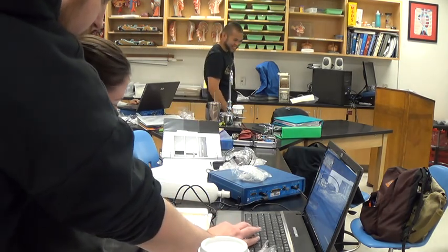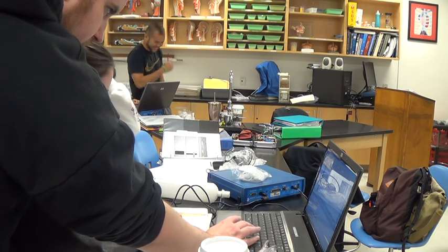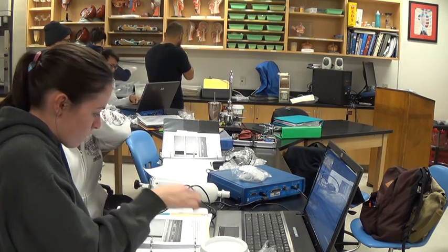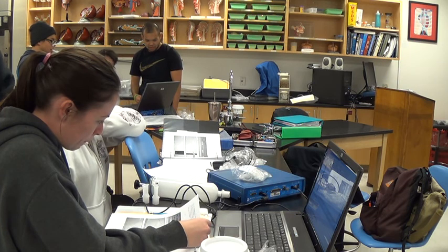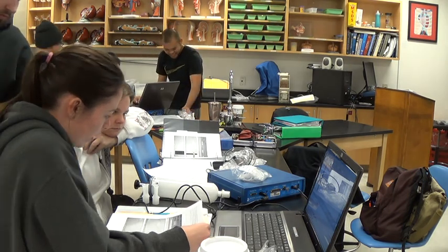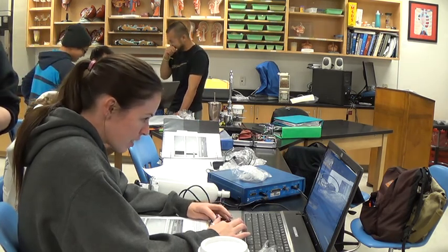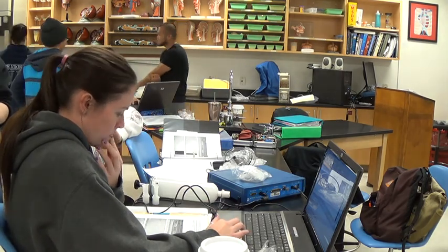So what we did last time, from the top, go down, okay. So your deltas, these values are going to change. So now it makes sense. Wait, is this supposed to be in seconds? Yeah. FEV1 is 0.99, right? So, 0.9. Oh, the delta goes here. Maximum inhalation, so 1.3. Oh, you're rounding up. And then the FVC is the delta. Grab a second of it, is what she's saying, right?